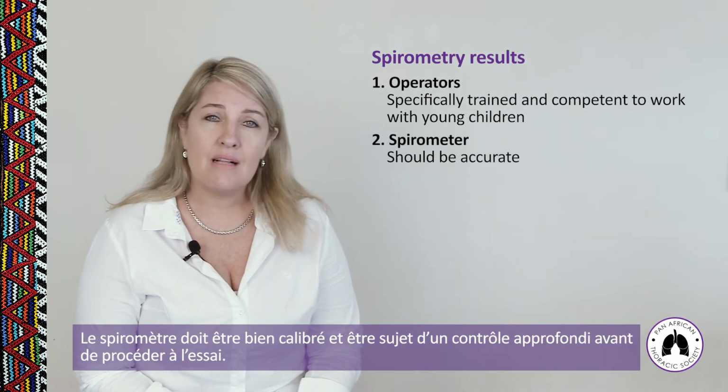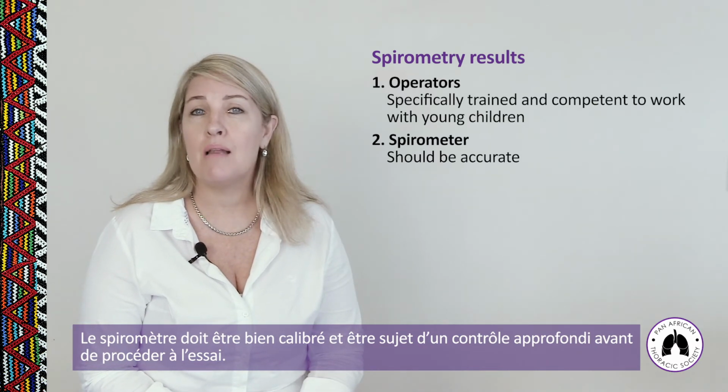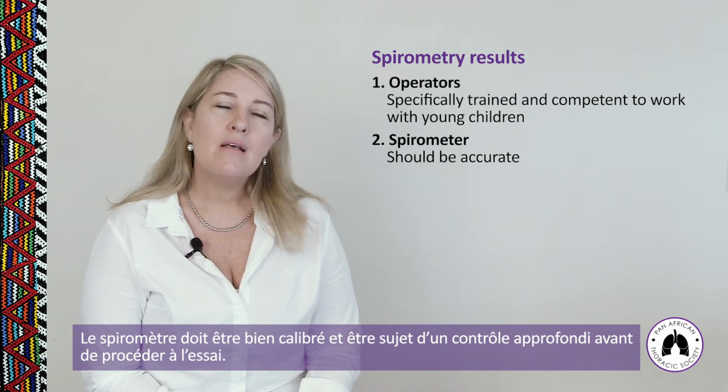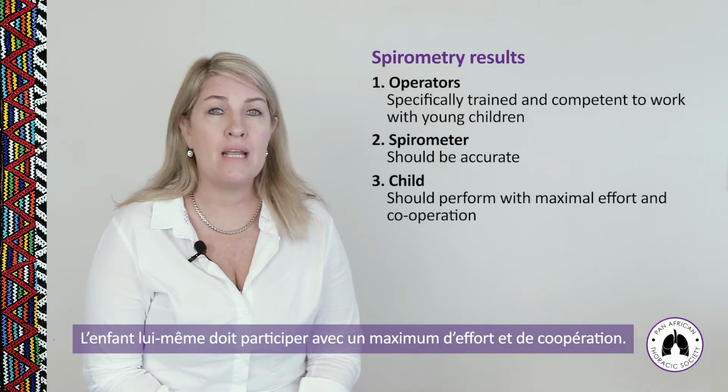The spirometer itself needs to be accurate, so we need to look at the spirometer and do some calibration checks on the spirometer before we use it to ensure that it is in perfect working order. The child themselves needs to perform the test with maximal cooperation and effort.